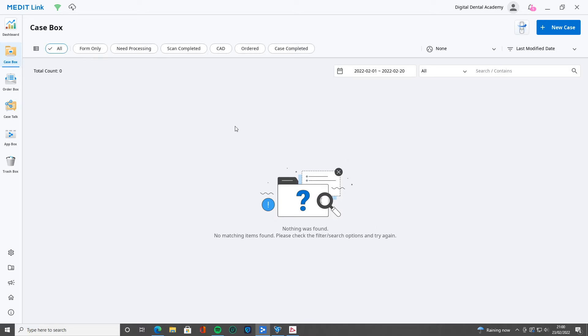So that once you create your case here in case box, you need to know how to send it to a lab.